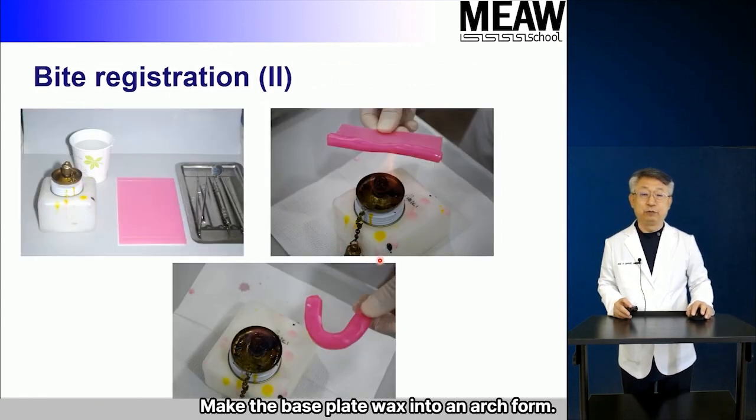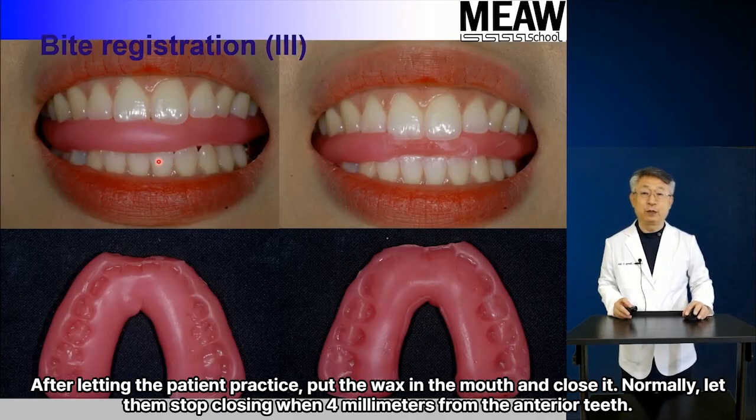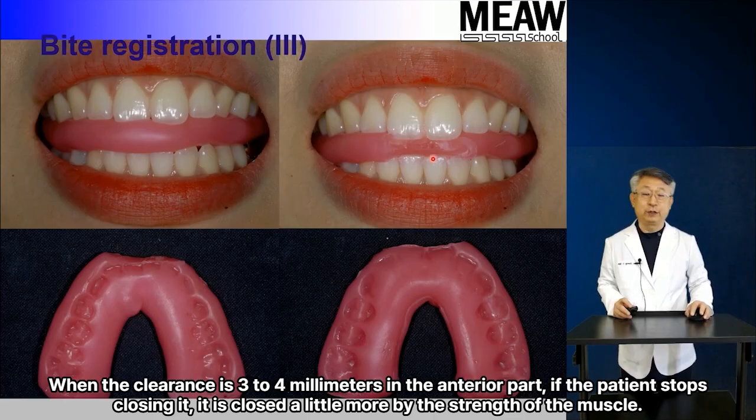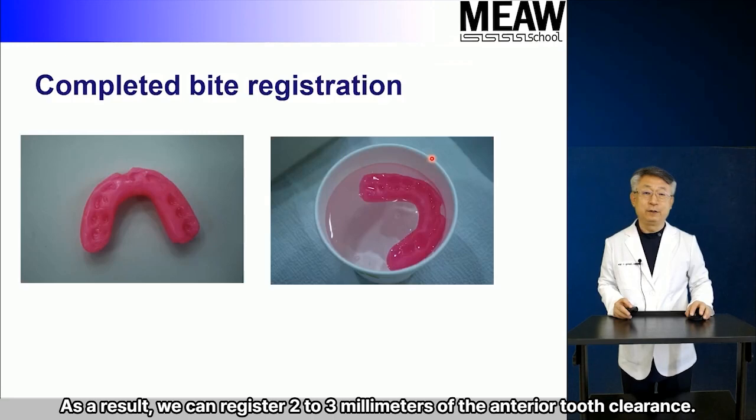Make the base plate wax into an arch form. After letting the patient practice, put the wax in the mouth and close it. Normally, let them stop closing when 4 millimeters from the anterior teeth. When the clearance is 3 to 4 millimeters in the anterior part, if the patient stops closing it, it is closed a little more by the strength of the muscle. As a result, we can register 2 to 3 millimeters of the anterior tooth clearance.